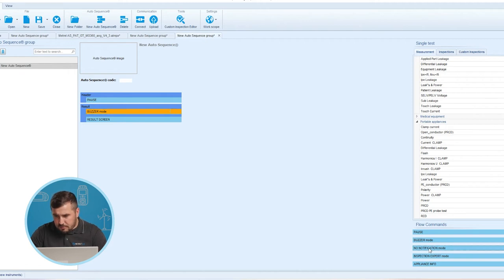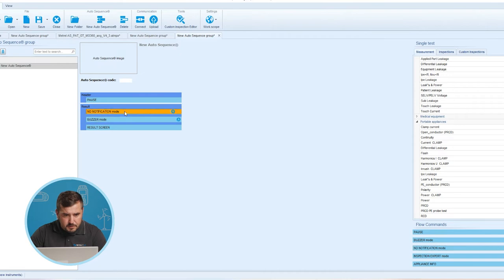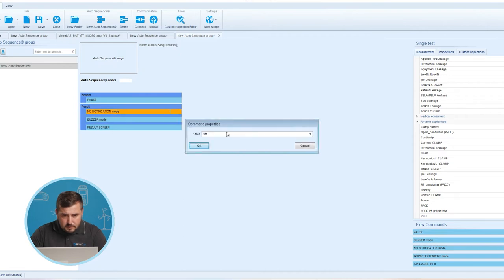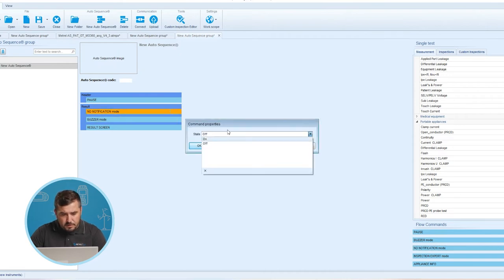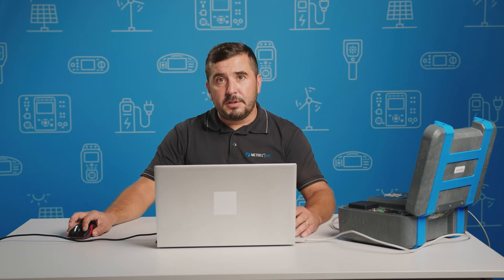The third flow command is No Notification Mode. Again it has statuses for On and Off. If this flow command is activated, the instrument skips pre-test warnings. For more information, see the user manual of the instrument under the chapter Symbols and Messages.